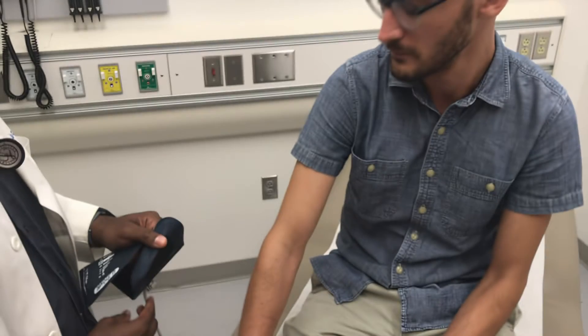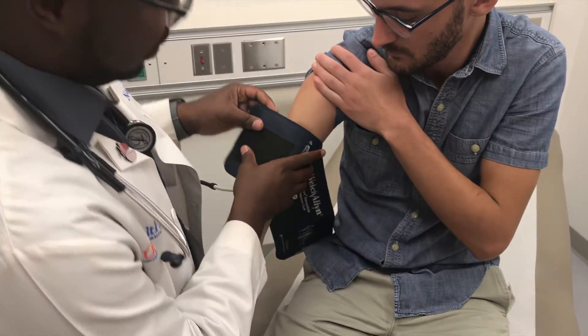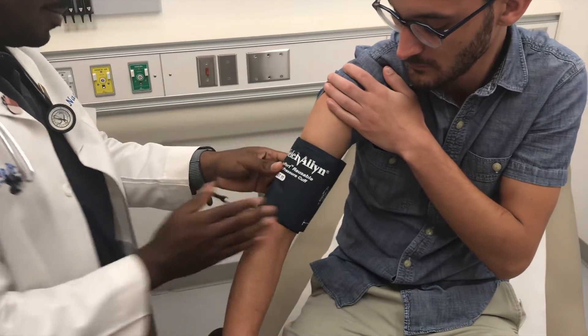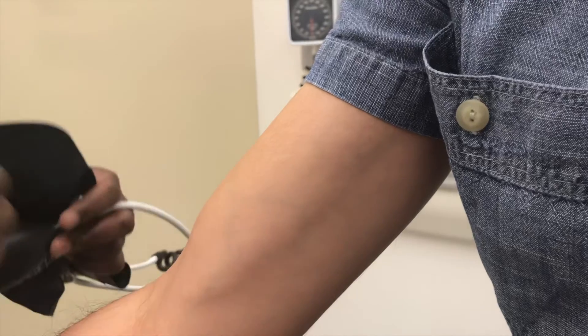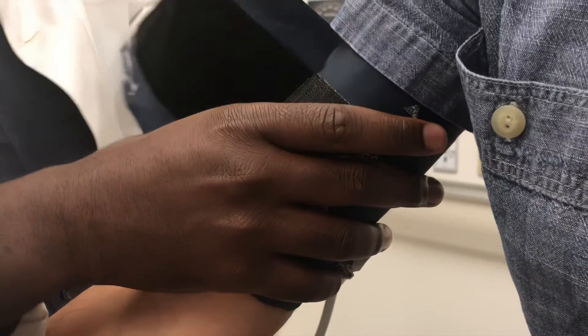Now that we've covered how to attach the cuff, we're going to play the next two clips demonstrating what we just discussed. Notice how the demonstrator makes sure that no clothing gets caught underneath the cuff, how they attach the cuff snugly but not tightly, and make sure the artery index marker is in the correct place. In this next clip, we show the artery index marker more closely, as it overlies the cleft between the biceps and triceps muscles. Once again, the cuff is attached snugly but not tightly.